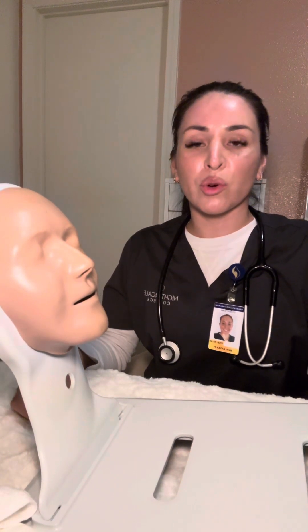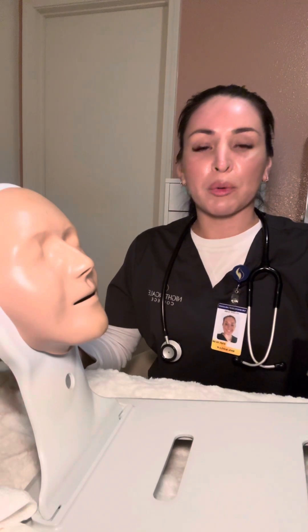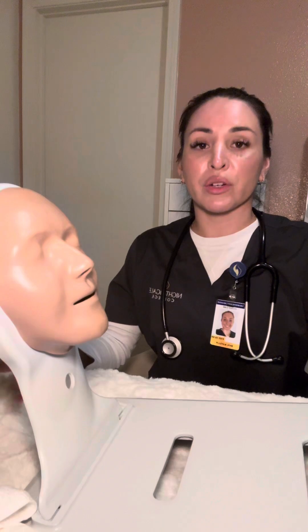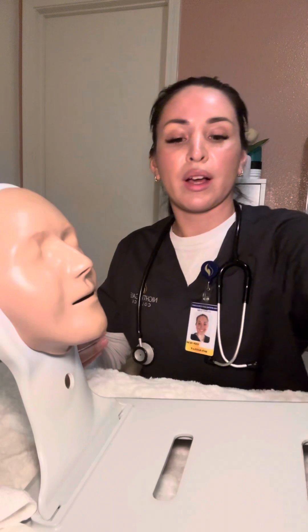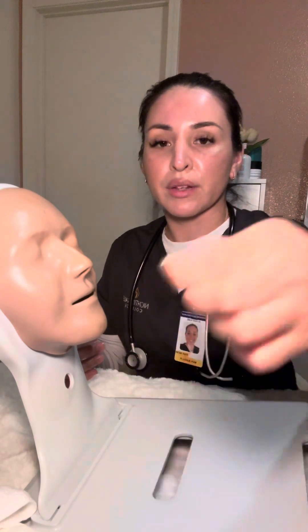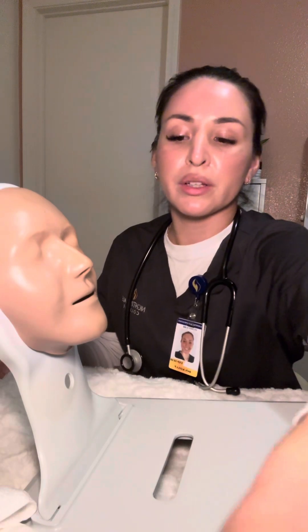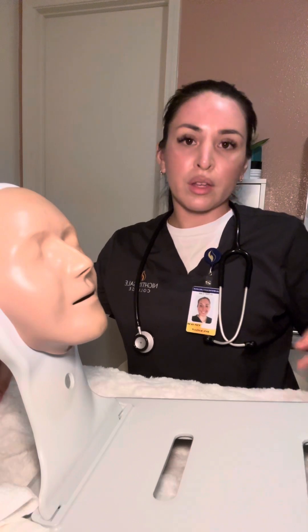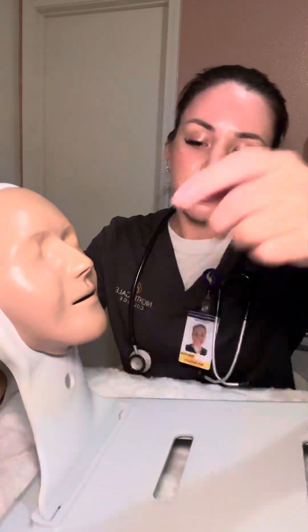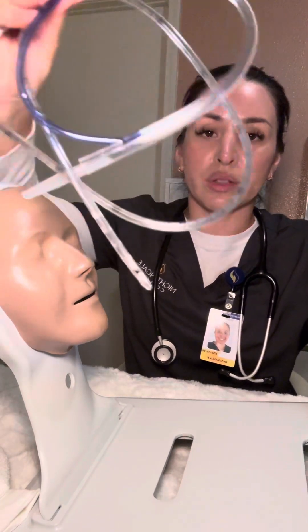Hi, my name is Kayla and I'm going to perform an NG insertion skills video today. I'm going to first verify the healthcare provider's order and gather all of my supplies. So we have a syringe, a basin of warm water, a safety pin, a water soluble lubricant, some tape which I've already prepared, a towel, an absorbent pad, and the tube itself.